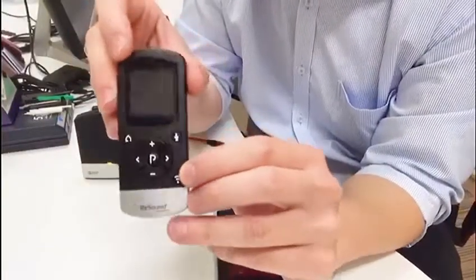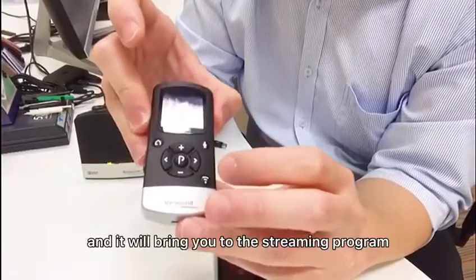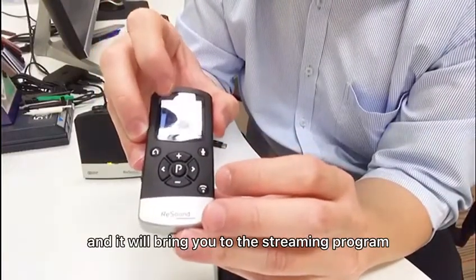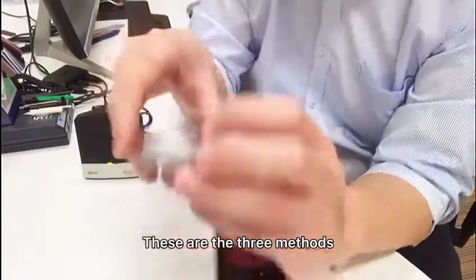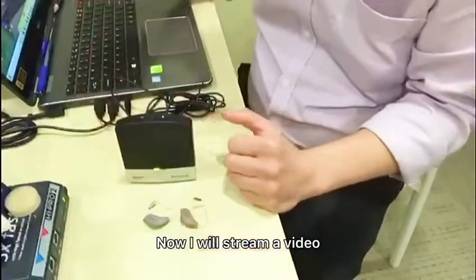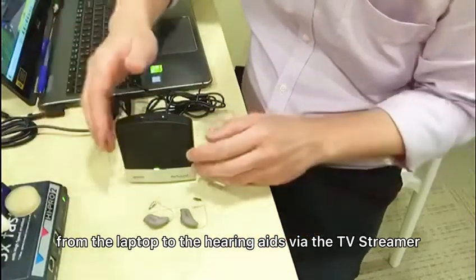Lastly, if you have a remote control, search for the wireless streaming button on the remote control and it will bring you to the streaming program. These are the three methods. Now I will stream a video from the laptop to the hearing aid via the TV Streamer.